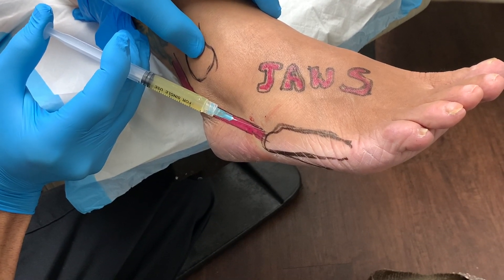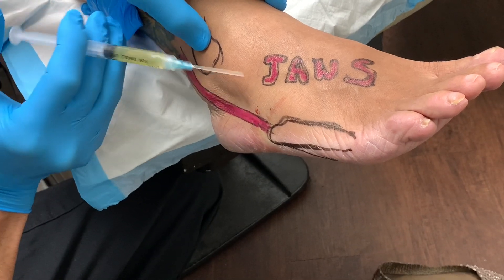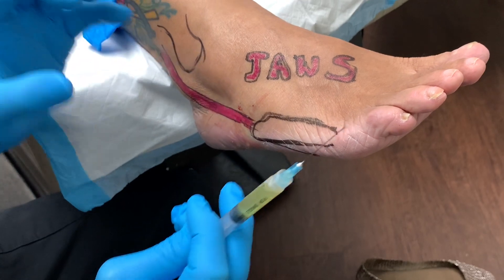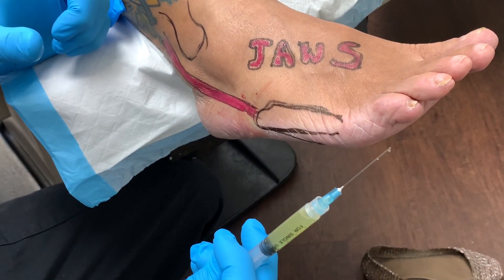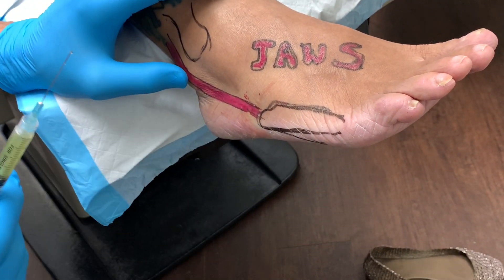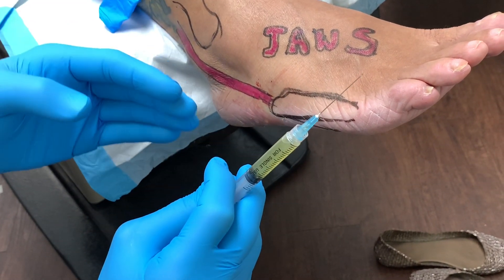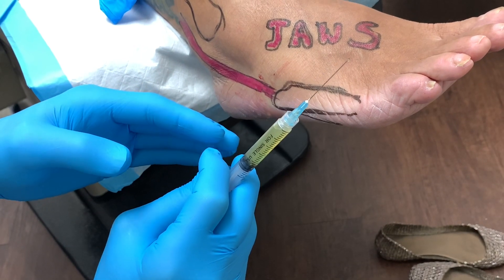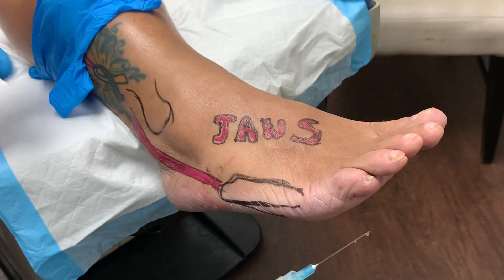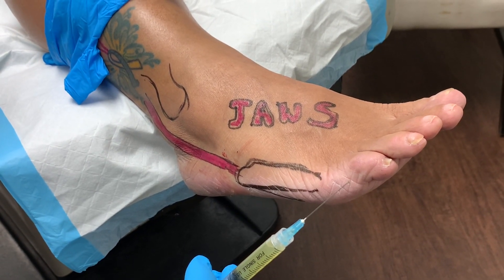You're doing okay? Yes. Excellent. We don't have to use all the PRP — the body actually tells us. It's a small space, so more is not necessarily better. I just want to infiltrate a little bit more here and that's it. We drew quite a bit of blood, so we have a very, very high concentration of PRP. We use it for heel pain, tendinitis, arthritis of the ankle and foot, injuries, fractures, acute injuries, ankle sprains — you name it. The sky's the limit.